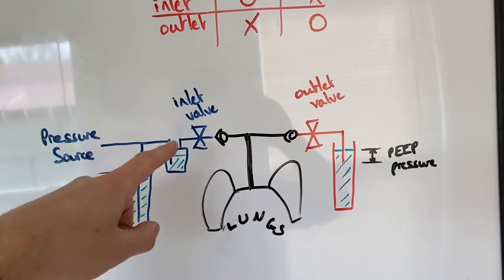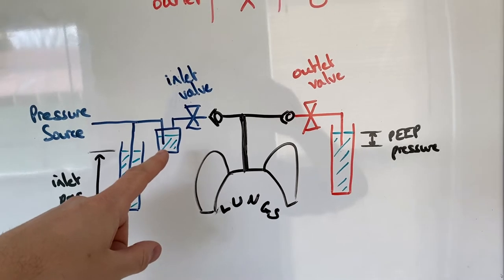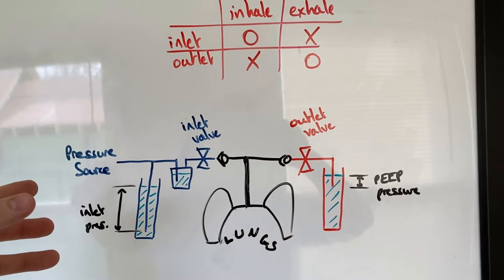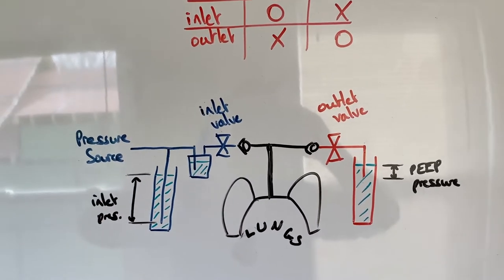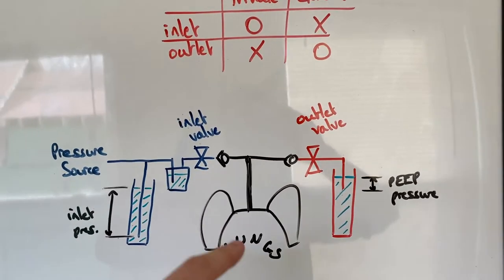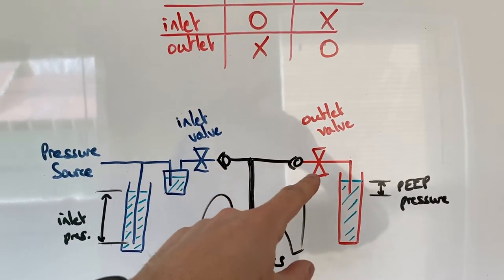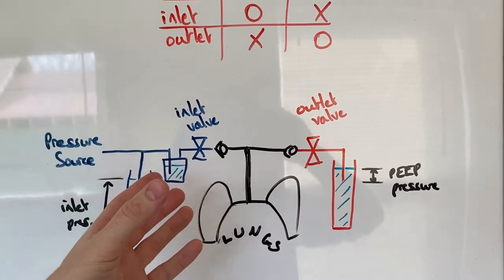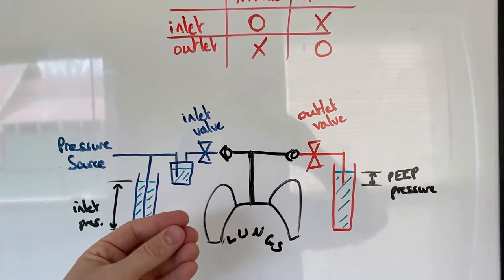The humidifier is a sealed box so all the air that comes in has to go out through the water. You increase the humidity this way because when you are intubating somebody, you're not getting the natural moisture from their nose and throat, so there's a lot more potential for dehumidifying their lungs. When the outlet valve is open and the inlet is closed, the lungs are compressed by atmospheric pressure and the air inside them is pushed out.